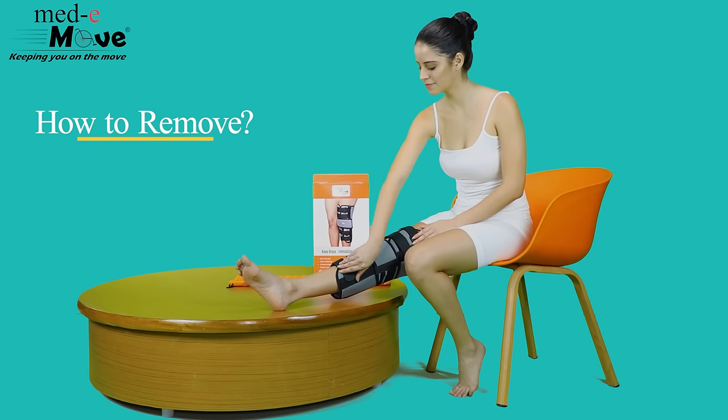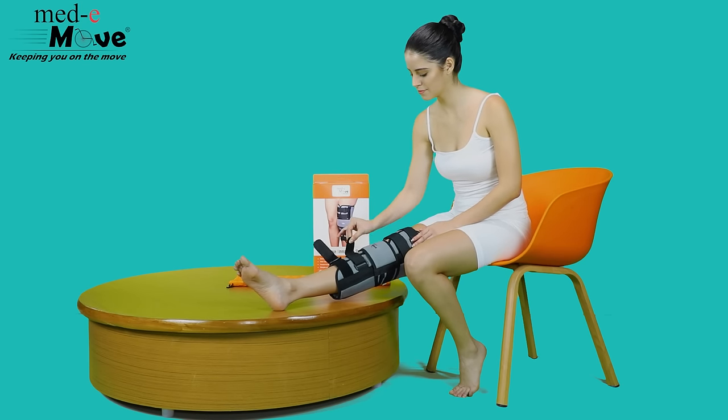Now let us see how to remove the knee immobilizer. Unfasten the hook and loop closures for easy removal.